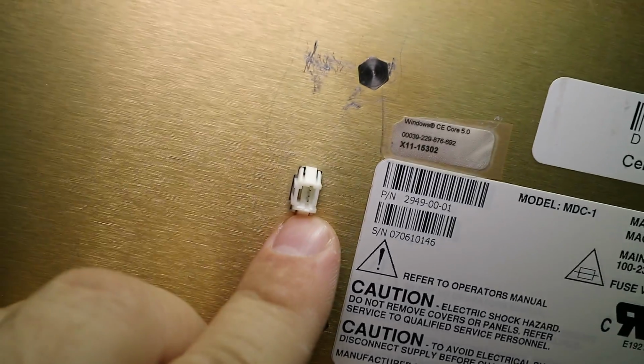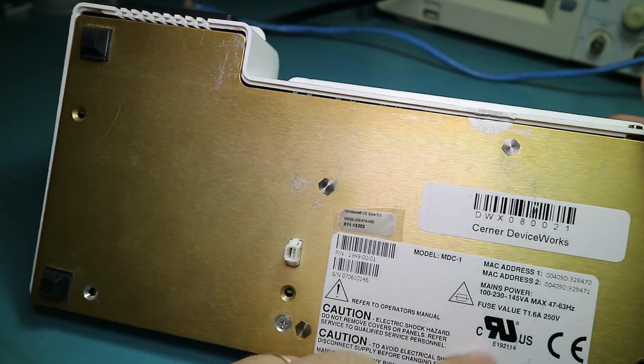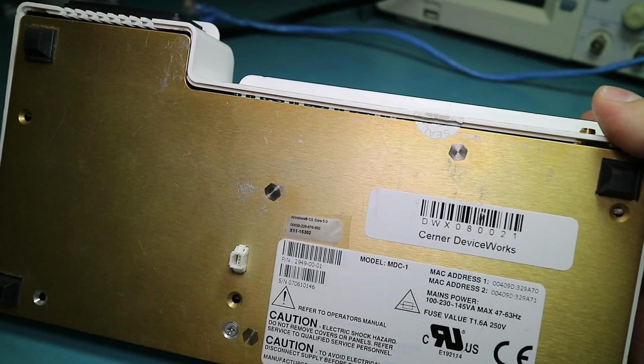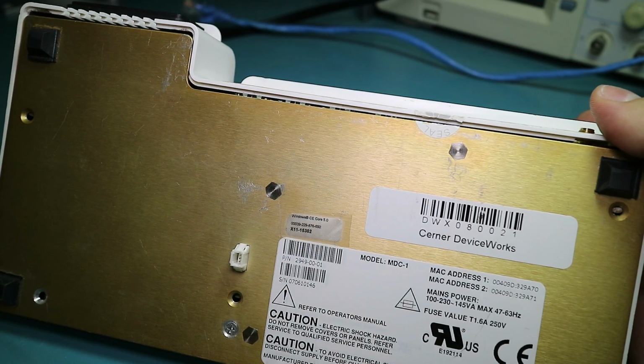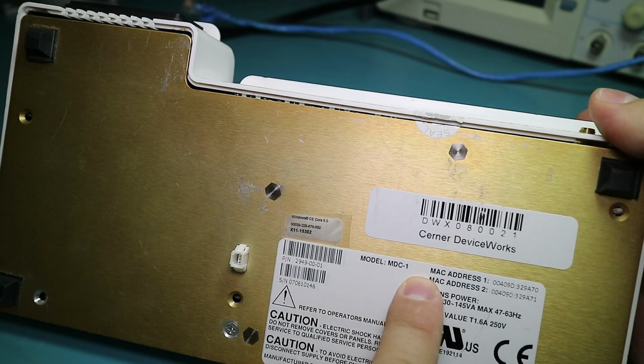I don't know what this goes to, possibly some kind of expansion module. It's got 3 pins, so I don't know what it would be doing, but you know, Cerner DeviceWorks. That seems to be part of the whole CareAware architecture nonsense. But it comes with some kind of serial number on it, and you can see it's got MAC addresses. Now this is the MDC-1.